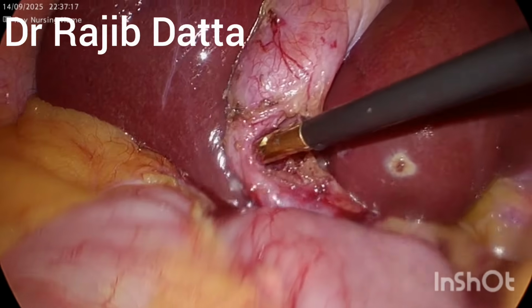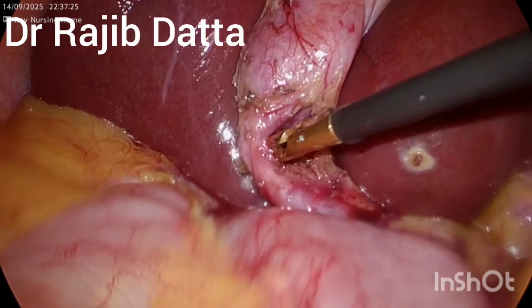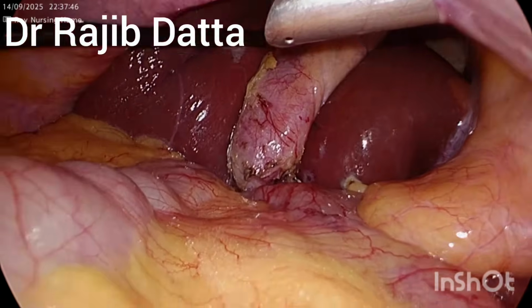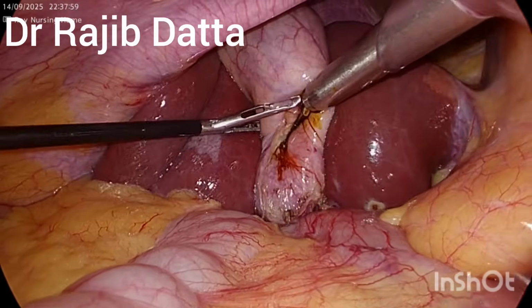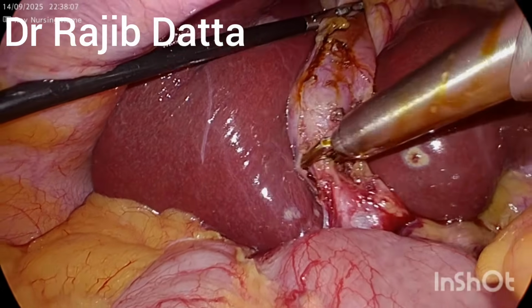So here you can see that the cystic artery and the cystic duct are well separated, and just below the cystic duct the CBD is seen. Now we are going to apply the clip. The 300 Liga clip has been introduced.